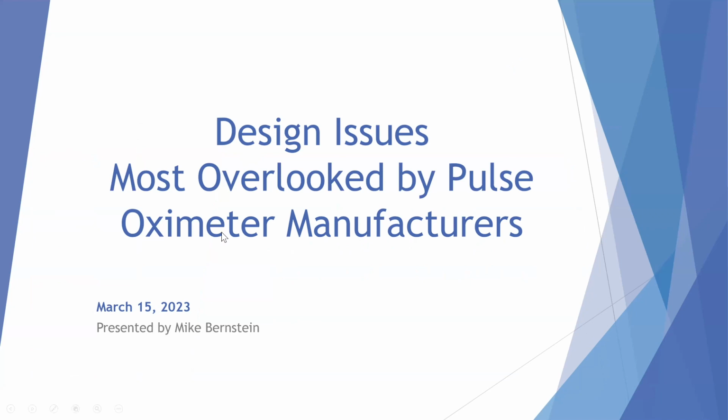And the perfusion index is a non-pulsatile signal because it's also drawn from the pulse oximeter, and it actually involves a DC component directly. Okay. How do you decouple that fact? I think what we need to do is analyze raw signals, so we can really understand. I mean, we use a perfusion index from a pulse oximeter. Exactly. So that's a processed signal, and so we produced a correlation, and I think correlation is not necessarily understanding. It's a relationship, it's not a mechanism. But I take your point.